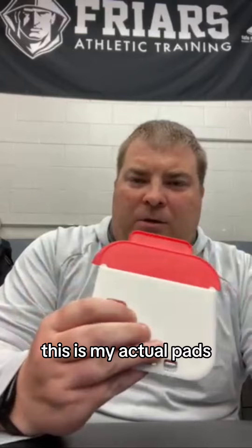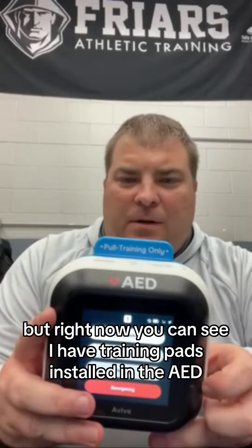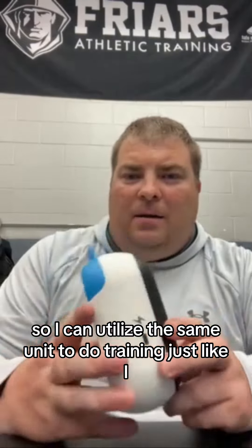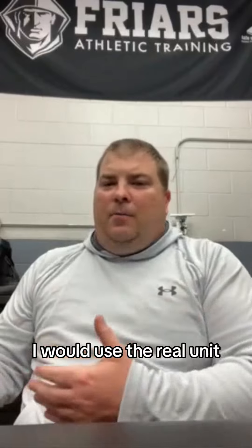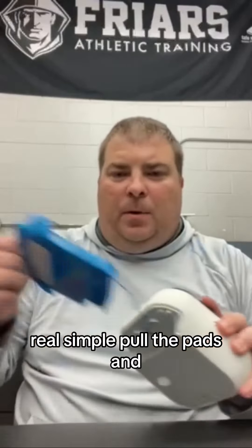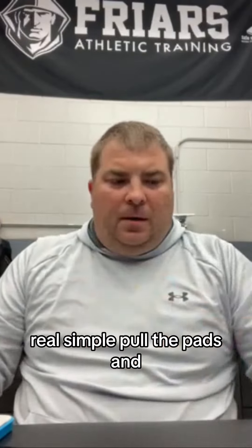These are my actual pads for an emergency, but right now you can see I have training pads installed in the AED. So I can utilize the same unit to do training just like I would use the real unit. Real simple — pull the pads, follow instructions. If the patient is under eight years old, you must press the child button on the top of the device.